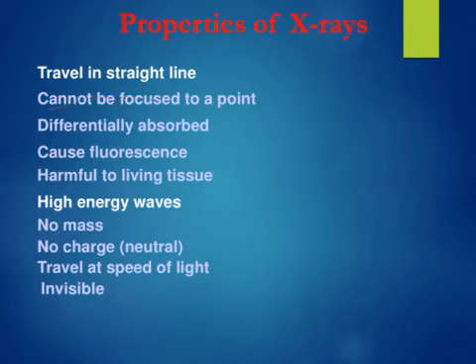So in the x-ray machine we make it a point to address this issue. Differentially absorbed, the solid, liquid, and gases, they are going to absorb it differently. Solid will absorb the maximum, then the liquids, and the last is the gas. Causes fluorescence. Now this is another important property which we are going to utilize in extraoral imaging.